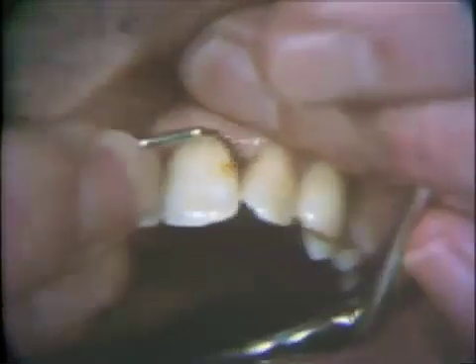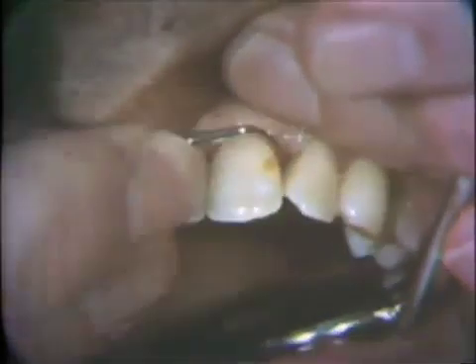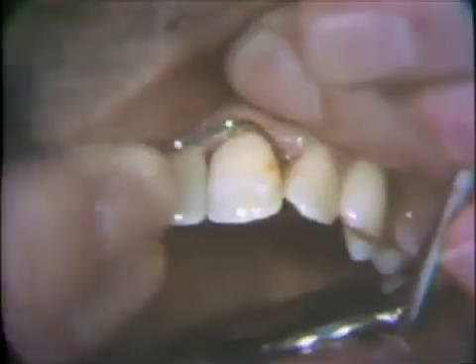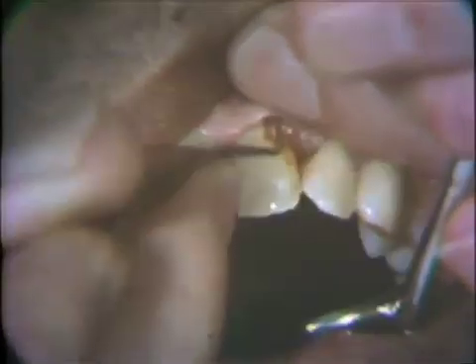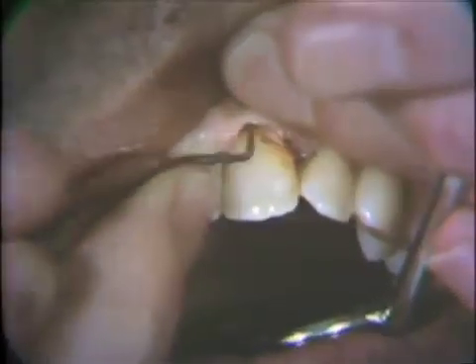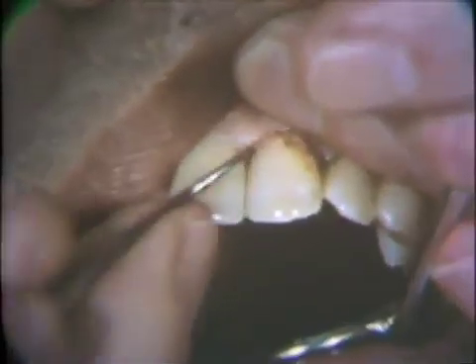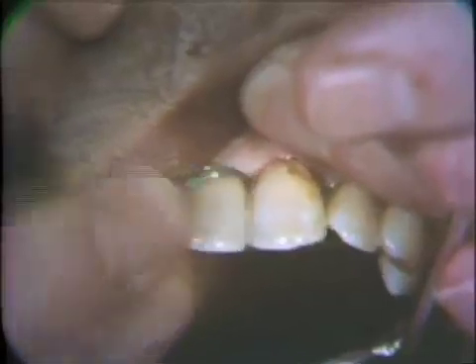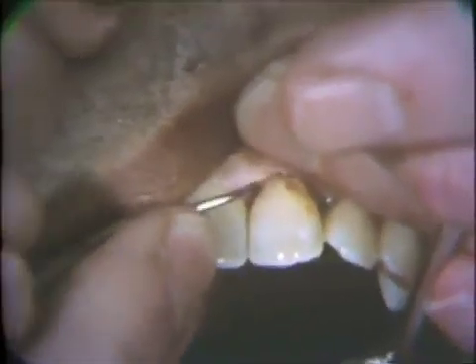The tooth surfaces are again planed with a curette or sickle scaler. Removal of contaminated cementum and dentine, in addition to removing local irritants, prepares the root so that new cementum may be deposited on the freshened surface. Reattachment and adaptation is most likely to occur on a clean, smooth tooth surface.